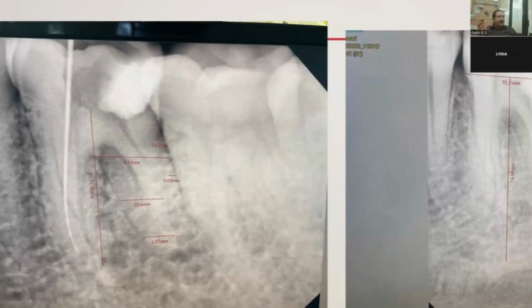So if you place a 3.3 implant exactly in the center area, you are expected to have some amount of interdental bone and implant-to-tooth bone. You will have around 1.5 on one side and 1 millimeter on the other side. If that 1 millimeter has to be kept closer, which area will you keep it closer to: the present sectioned area or the nearby tooth area? Which one will you have?